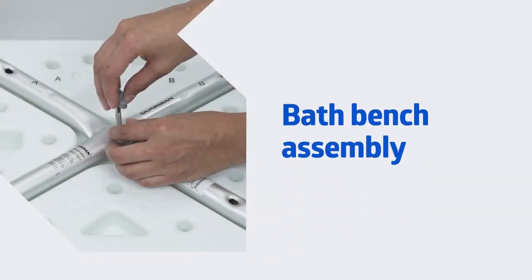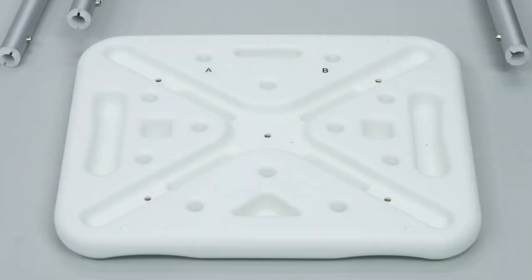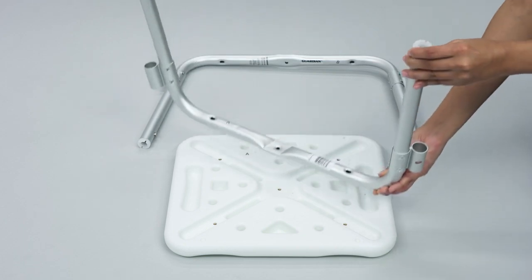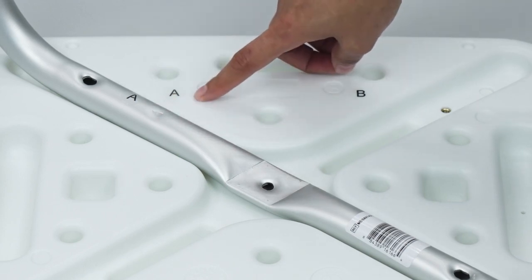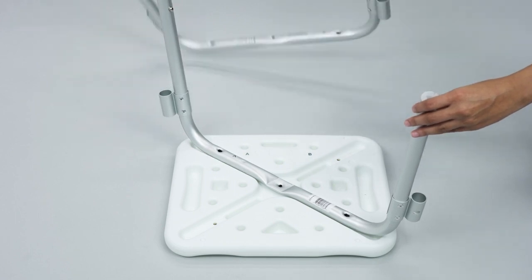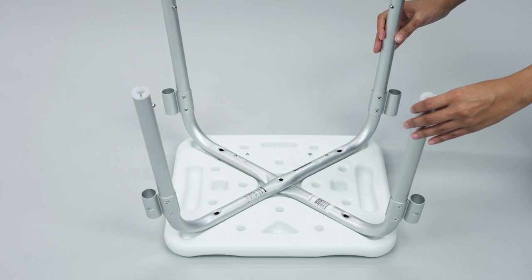This segment is going to go through setting up your MDS-89740RWA bath bench with arms. Place the seat bench upside down on top of a raised flat surface. Insert the mainframe with an A imprinted on it into the indentation on the underside of the bench with an A imprinted on it. Insert the mainframe with a B imprinted on it into the indentation on the underside of the bench with a B imprinted on it.